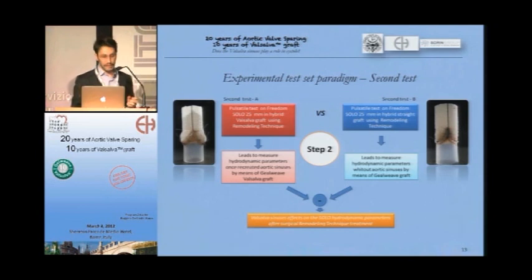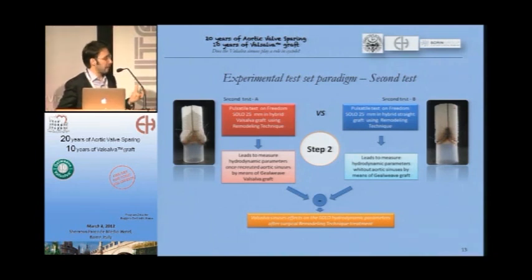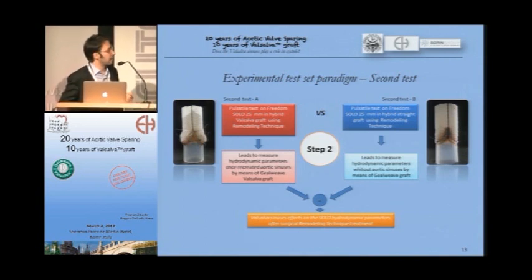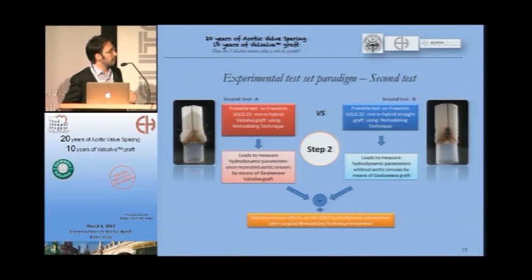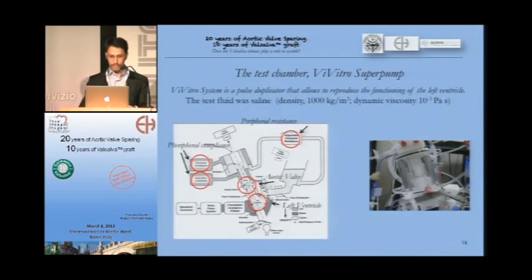With this second test, we evaluated the Valsalva sinus effects on the hydrodynamic parameters of the Solo stentless valve, like we can find after surgical remodeling technique treatment. So we mimicked the remodeling surgical technique treatment.